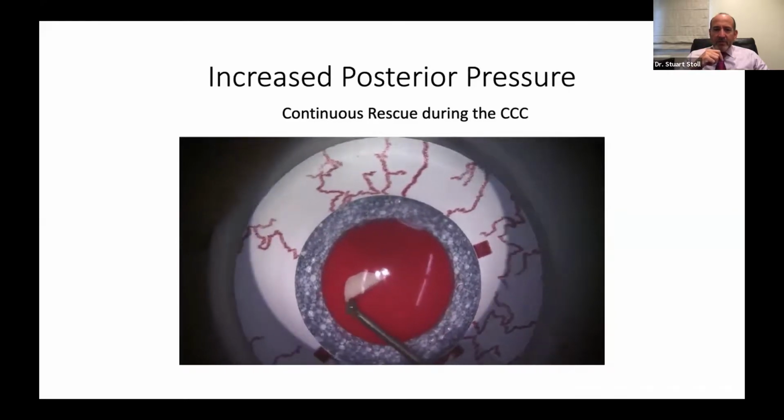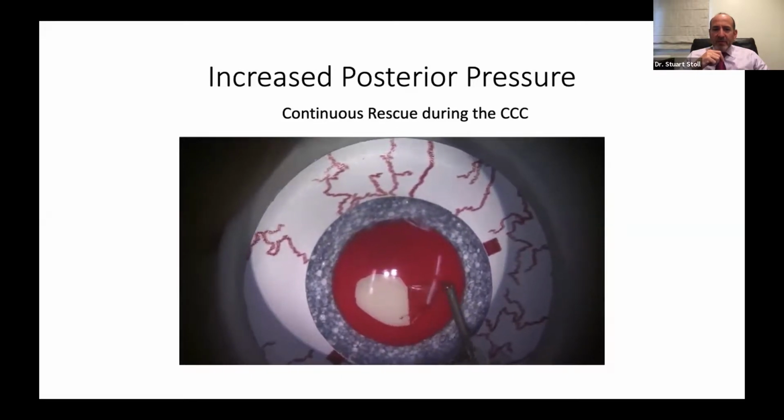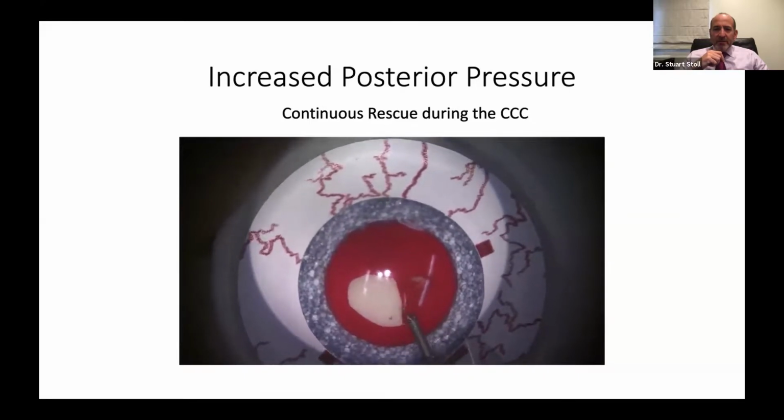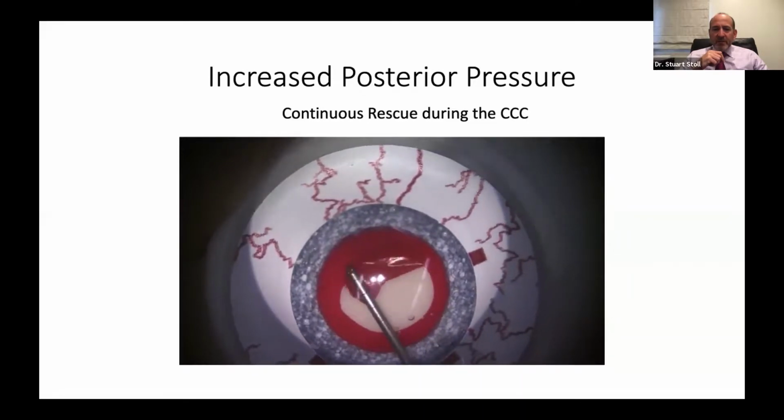Everything's under control. We've initiated the capsule. We flipped it over. We've got great control. We're going to regrasp here. Tension off versus tension on. There's off. There's on. Tips are out. Everything's just going perfectly. What could possibly happen?